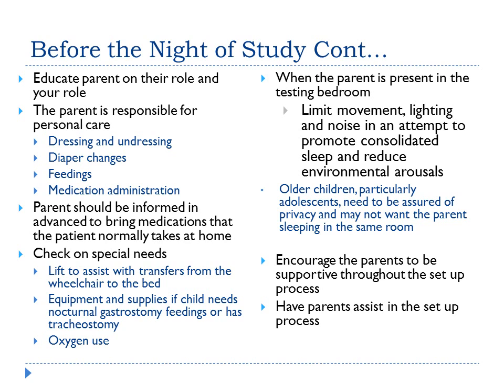Older children, particularly adolescents, need to be assured of their privacy. They may not want the parent in their room, so you need to be cognizant of that. Encourage the parents to be supportive throughout the setup process and have them assist you as they can. Let's go on to our next slide.